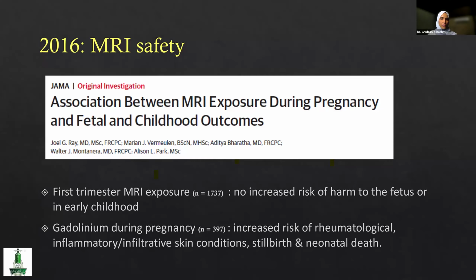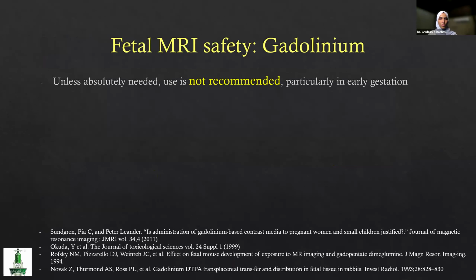However, they did find that gadolinium during pregnancy was associated with increased risk of rheumatological diseases, inflammatory and infiltrative skin conditions, as well as stillbirth and neonatal deaths. So the use of gadolinium during pregnancy is not recommended unless absolutely needed, particularly in early gestation.